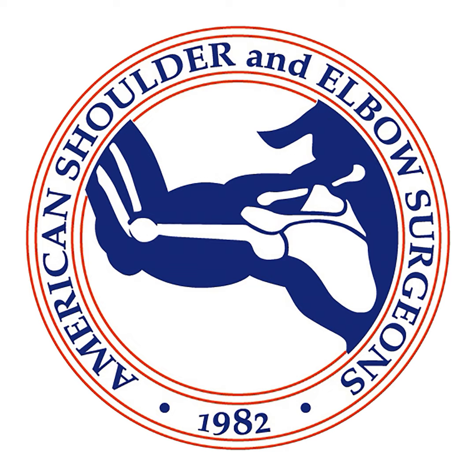Then it's just like fixing a rotator cuff. Typically, you can pull the graft laterally, tension it appropriately. I'll usually put little tagging sutures on the corners, which I can pull out percutaneously just to get it spread out and kind of hold it in a good position. And then I can just bridge it over to a lateral row of anchors. But trying to pass the graft with multiple tapes going through it can be very challenging. So I just do that once it's inside the shoulder and do them one at a time, either with a shuttling device, which is my preference, or you can use a direct passing device. And there's a variety of manufacturers that make those that can go through the graft as well.